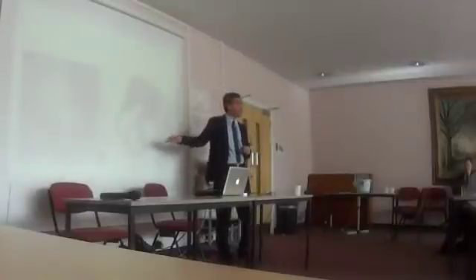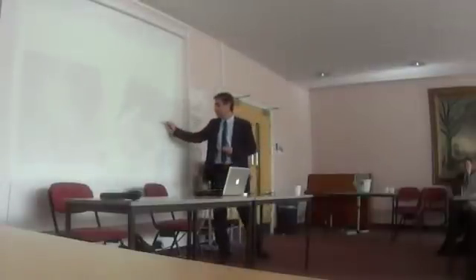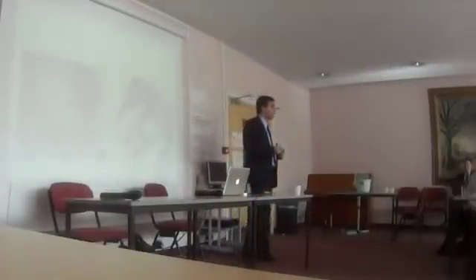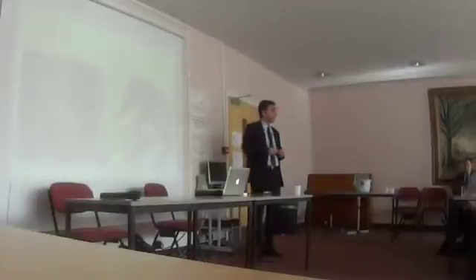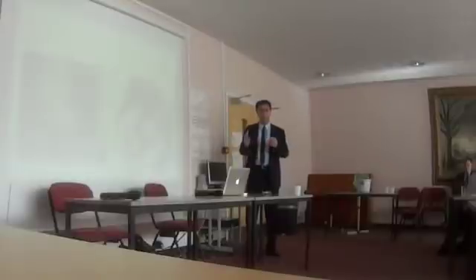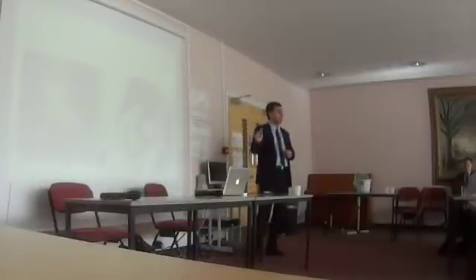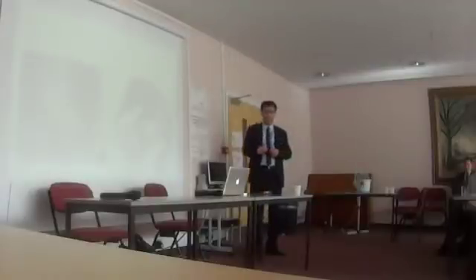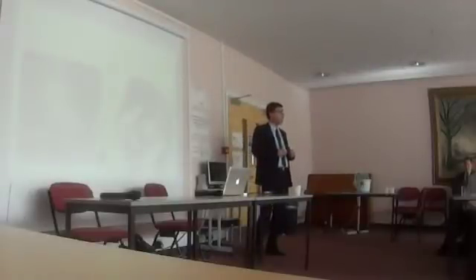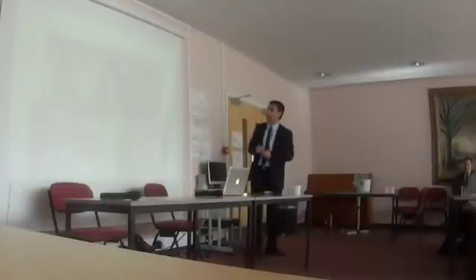We applied the gadolinium, although we did not see any gadolinium apart from a touch here. There was no significant gadolinium enhancement or scar in this patient. There are other modalities that we can use. We are good at looking at what we call replacement fibrosis scar, but we are not good with this methodology at looking at the interstitial fibrosis. But there are more sequences coming that we can apply with the MRI to look at more details of the interstitial fibrosis.